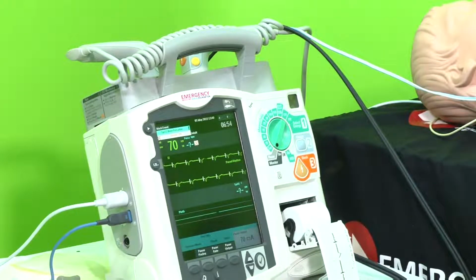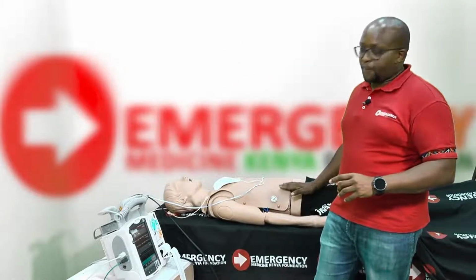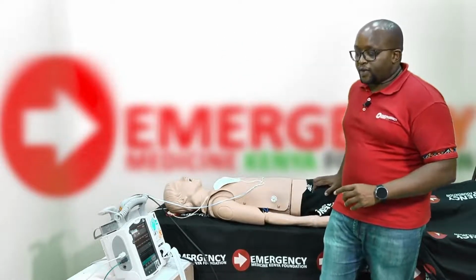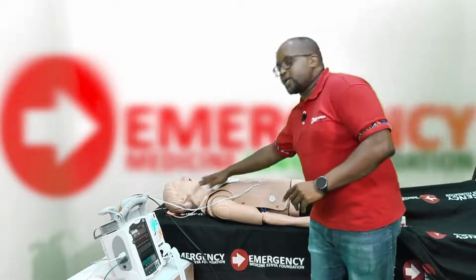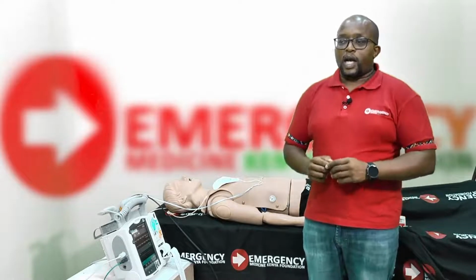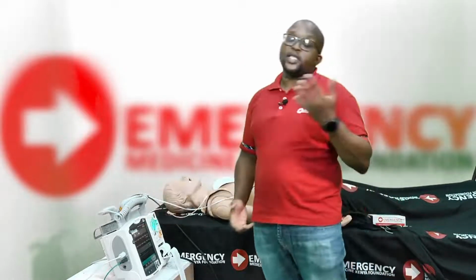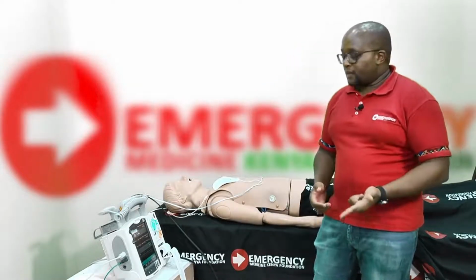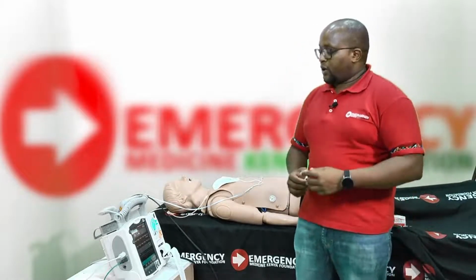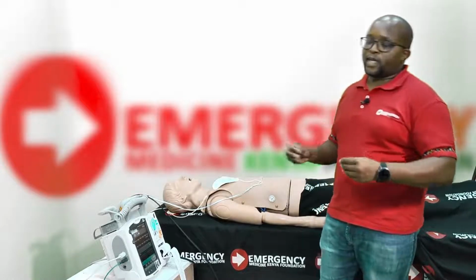Now I need to confirm that what I'm seeing here is exactly what's happening on the patient. So I will feel the femoral pulse. I don't want to feel the carotid pulse, because your patient sometimes is twitching at potentially 70 twitches per minute, because that's what you set. That's why it's important to give some analgesia and some sedation for the patient. I don't want to confuse the patient's twitches with the pulse.